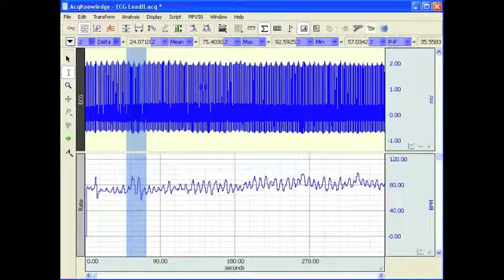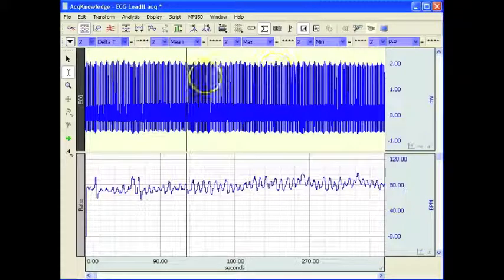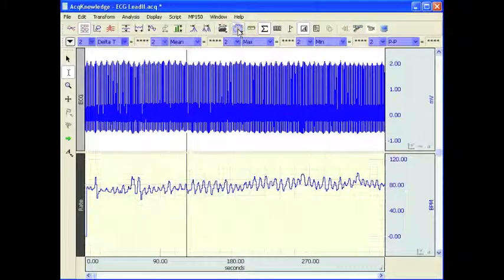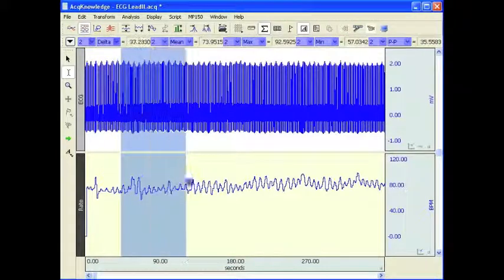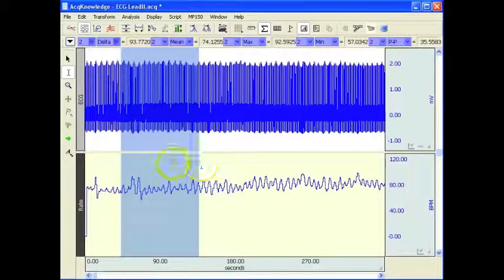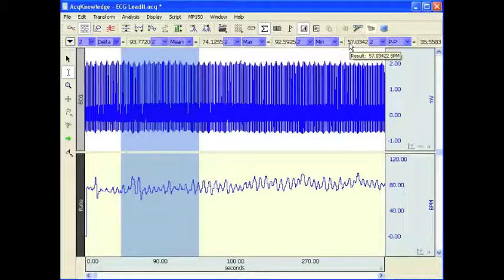Here I have already opened up a file that contains an ECG waveform and the associated heart rate. I'm going to turn the grid off. I've already set up my measurement boxes so that when I highlight an area I'm actually recording the delta time period. This is 93 seconds, so this shaded area represents 93 seconds, and the mean heart rate is 74 beats per minute. The maximum is 92 within that window, and the minimum value is 57 beats per minute.